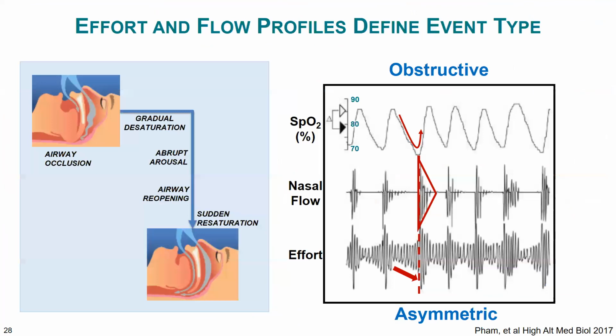Now, if you drill down further, you can see even more evidence in the recording itself, because the obstructive episode is really characterized by an abrupt, asymmetric pattern. Remind yourself that in nasal airflow, airflow ceases, but obstructive breaths continue here. The respiratory effort shows an augmenting response to the upper airway obstruction. And with that response, increasing degrees of asphyxia increase the ventilatory drive, and we see that increase in ventilatory drive with the increase in respiratory effort. But the airway is occluded, so we're not generating any ventilation.